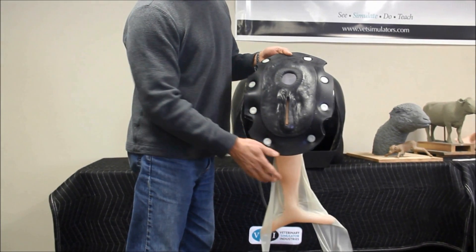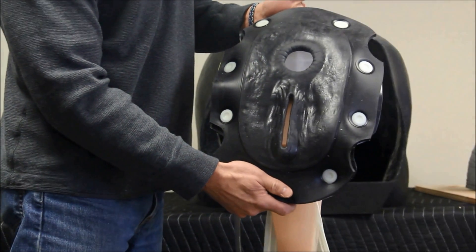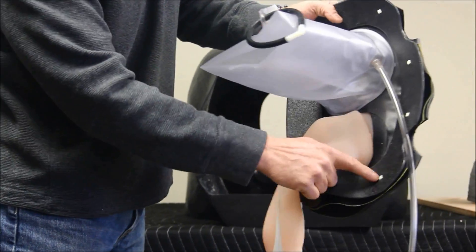This is the equine palpation assembly, which is also a replaceable part. It has a soft perineum panel with anal and vulva openings, which is mounted to an ABS plastic ring via plastic fasteners.